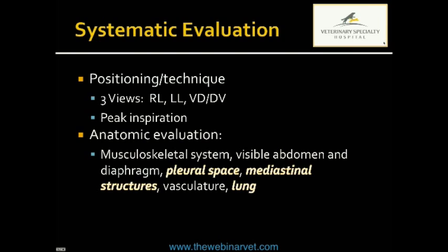Similarly, we attempt at peak inspiration. Certainly there are some respiratory conditions that are going to make that difficult, but the goal, again, is to maximize lung expansion in case there may be subtle lesions that you could miss if it's a very expiratory radiograph.